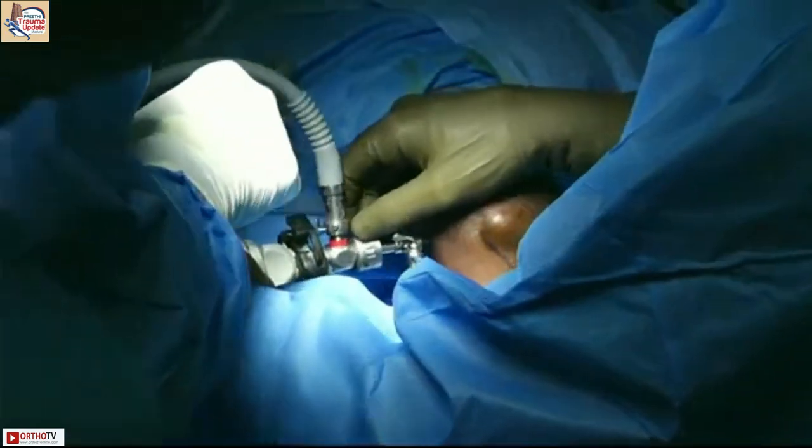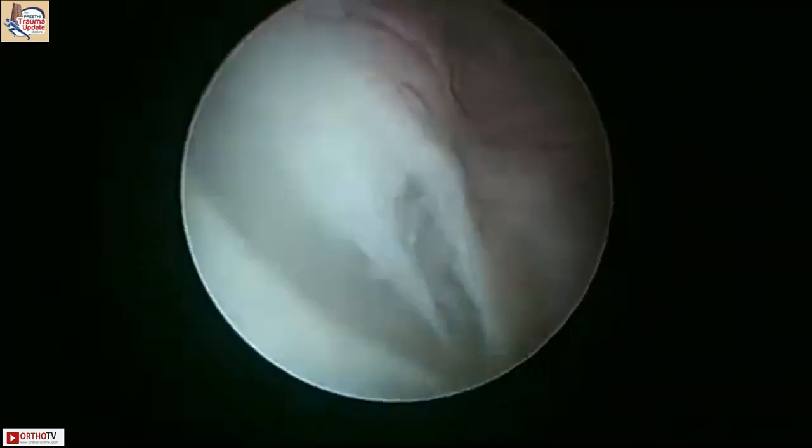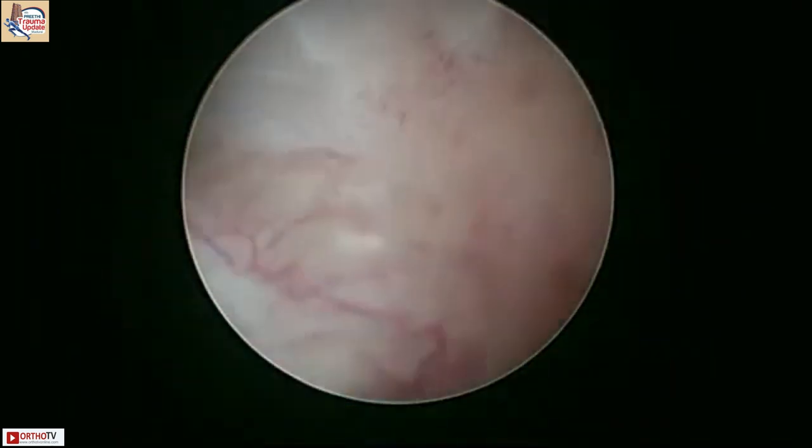Okay, all right, let's start the fluid. Fluid's on. Okay, so we're in the joint. You can see synovitis as expected. I can see that. Just give us a brief round into the joint. What would be the first time to look around and how do you proceed?